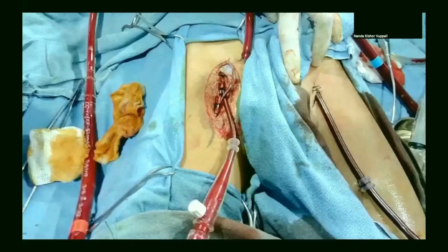So this is a pediatric patient who went on veno-arterial mode of ECMO for viral myocarditis. So yeah, this is a drainage cannula which is put in by the percutaneous method, and this is a return cannula which was done by open cut down, by surgical cut down. So we cannulated the femoral artery. Because we cannulated the femoral artery, we worry about the distal perfusion of that leg. So to prevent distal perfusion problems, we put another cannula to maintain the distal perfusion. This distal perfusion catheter is again connected to the main cannula through a Y junction, which is not shown here.